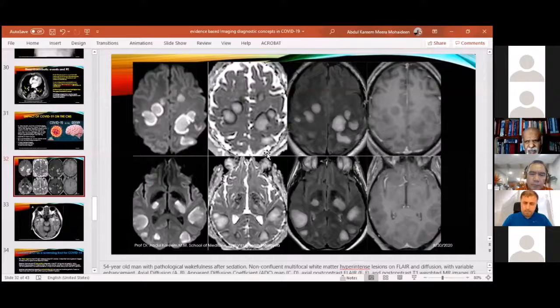Yes. Definitely, all the sequences of MRI like this, you can apply to prove whether it is a solid lesion or a fluid lesion; FLAIR also can be used. All these sequences are applied properly to differentiate various lesions. But initially in COVID, it will be a destructive lesion. So as you said, the diffusion sequences will be very useful, no doubt about it.